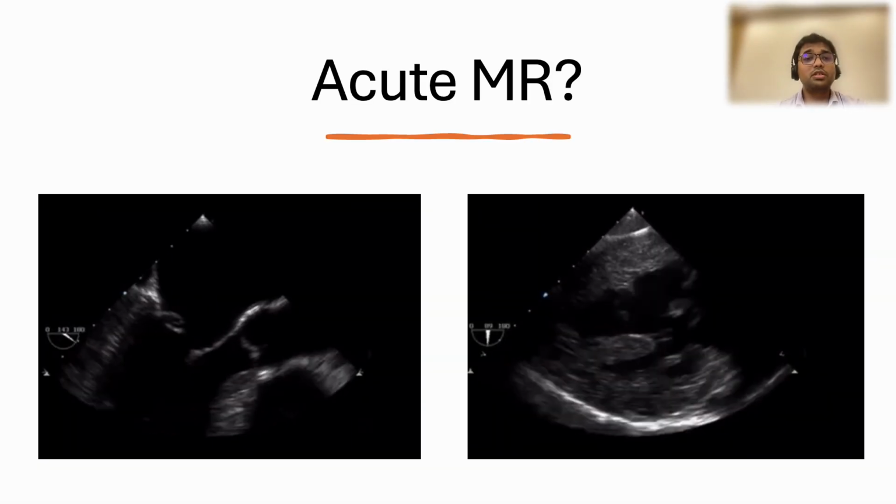Now hemodynamic instability has many things to do with your acute MR. So you can see over here in an acute MI patient there is an avulsion of your posteromedial papillary muscle. This is an avulsion from your posteromedial papillary muscle, and this is actually floating in the LA, and also there is a flail of the posterior mitral leaflet.